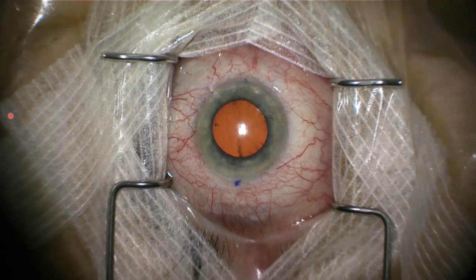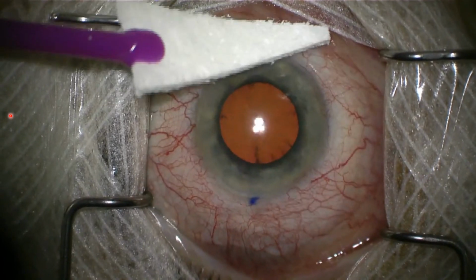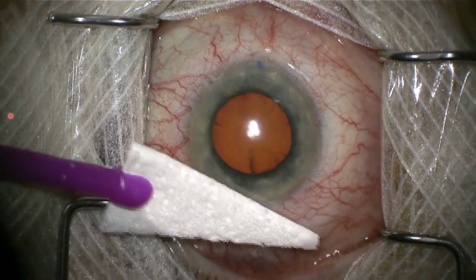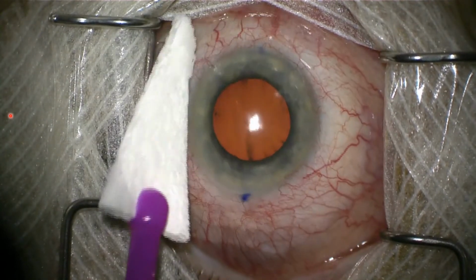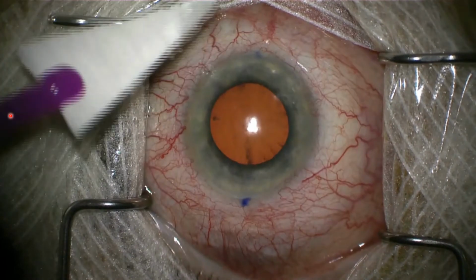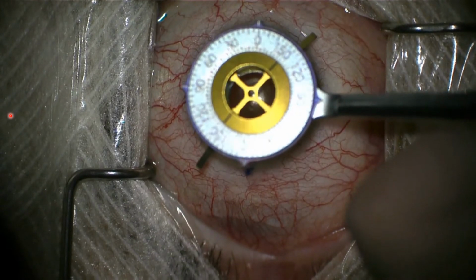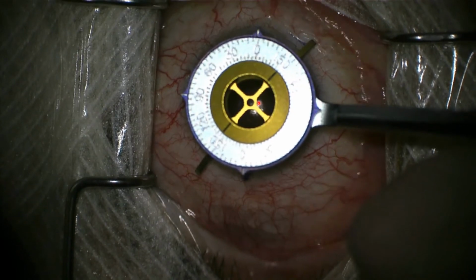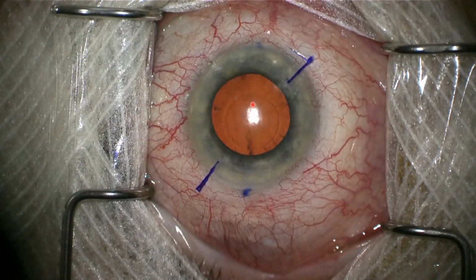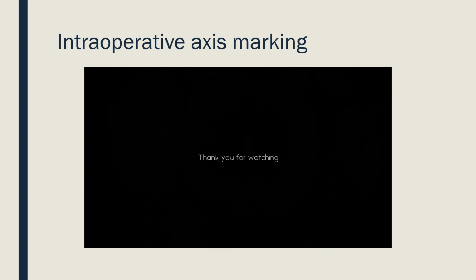It's important that you then dry the ocular surface with a spear, particularly around the areas that you're going to be placing the marks, in order to get the most precise mark possible. So then we've inked the underside of the gold blades, and you align the corneal light reflex with the centre of the dual axis marker and push down firmly to achieve 2 nice marks which will guide alignment, and these marks almost always last the duration of the case.